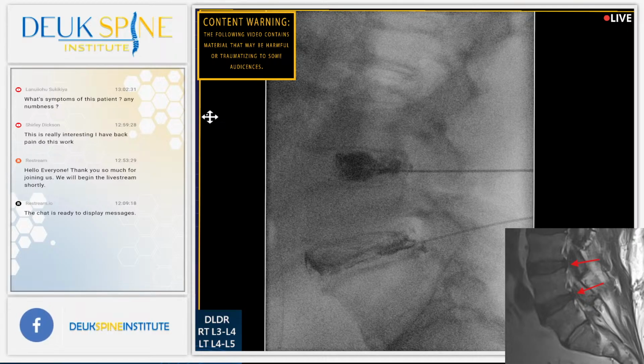All right, folks, we just verified that his lower back pain he's had for over 2 years now, it's debilitating. He's actually, unfortunately, lost his job as a result of that. I can't tell you any other information. But we're going to get rid of that pain today with this laser procedure.